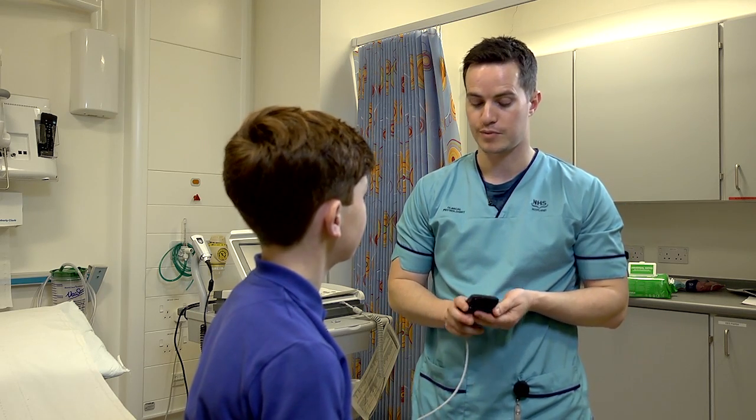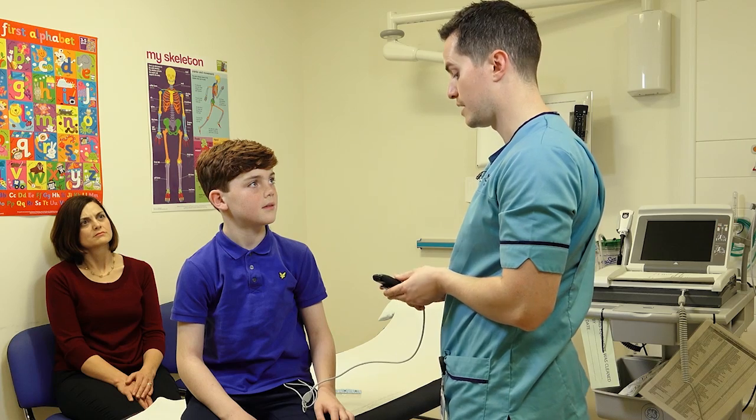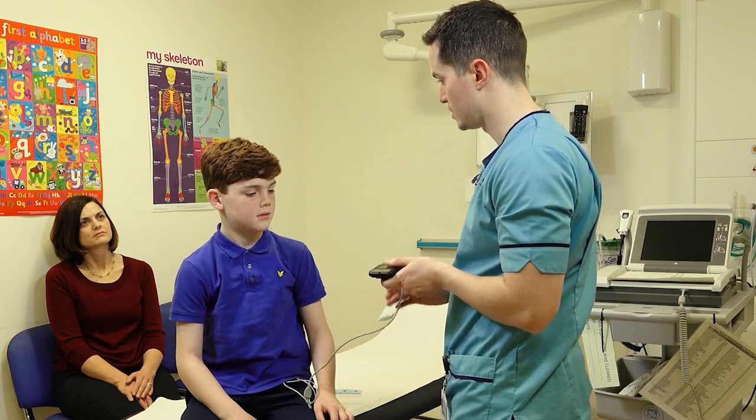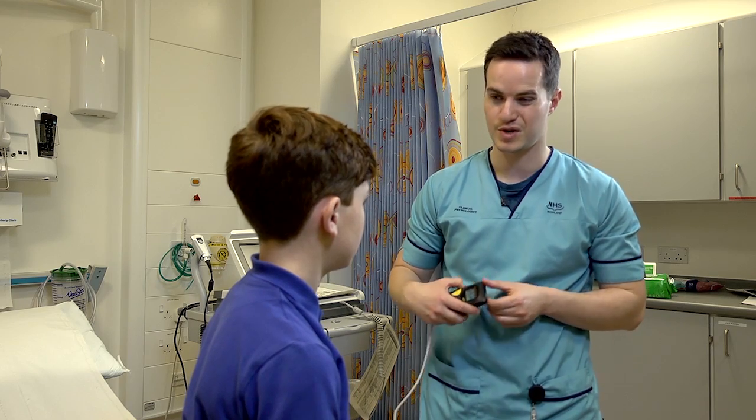When you go to sleep tonight, it's probably going to be easiest if you put it in a pocket that's in your pyjamas. Or the wire is a little bit longer, so you may be able to stick it by your side or put it underneath the pillow.